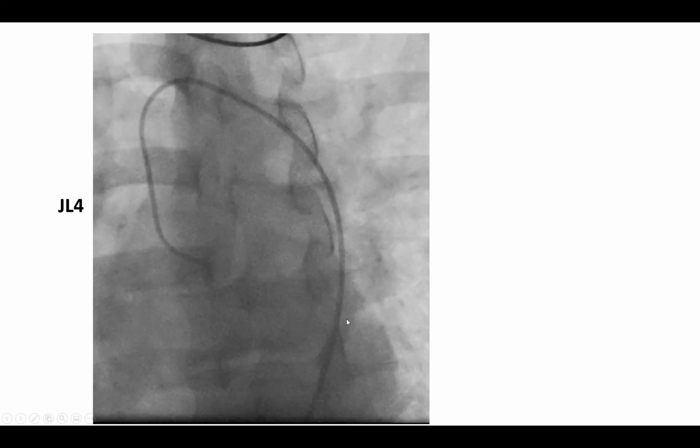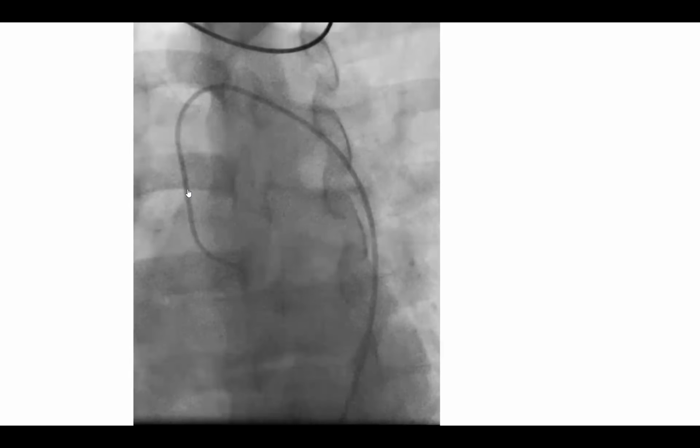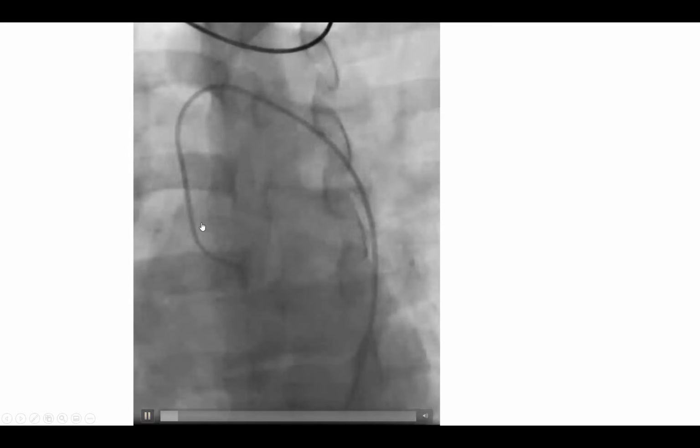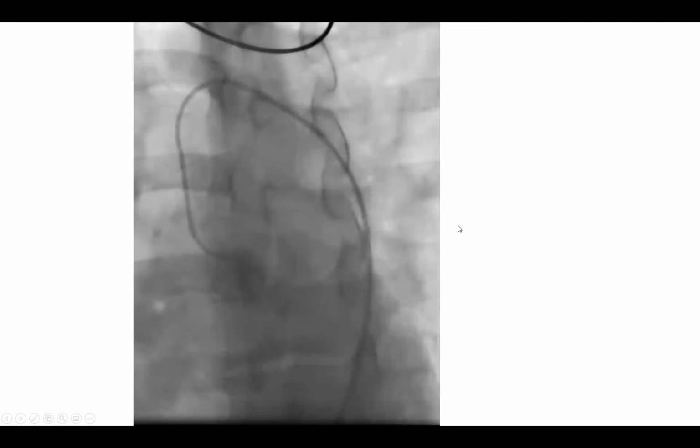How to engage the left coronary? You should know: you see this shape, it's an elongated catheter with a tip pointing down. You need a shorter arm. You don't need contrast. You immediately know you need a shorter arm. But here I'll show you with contrast if you don't believe me. So look, you inject contrast, it's pointing down below the coronary. You need a shorter arm.